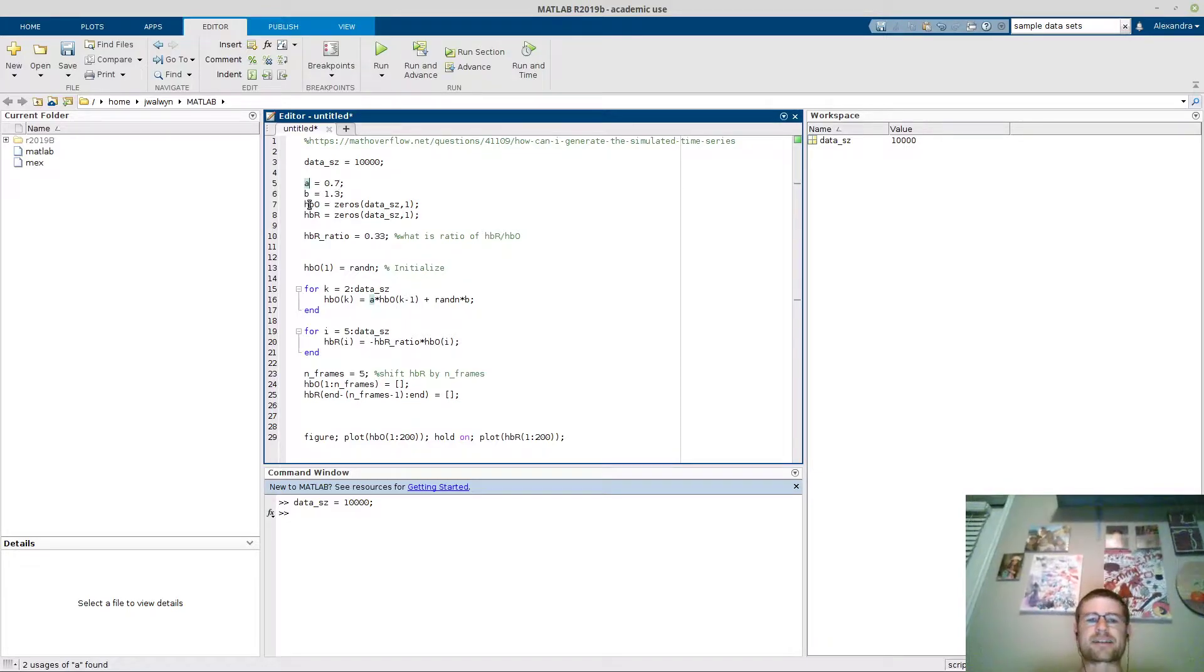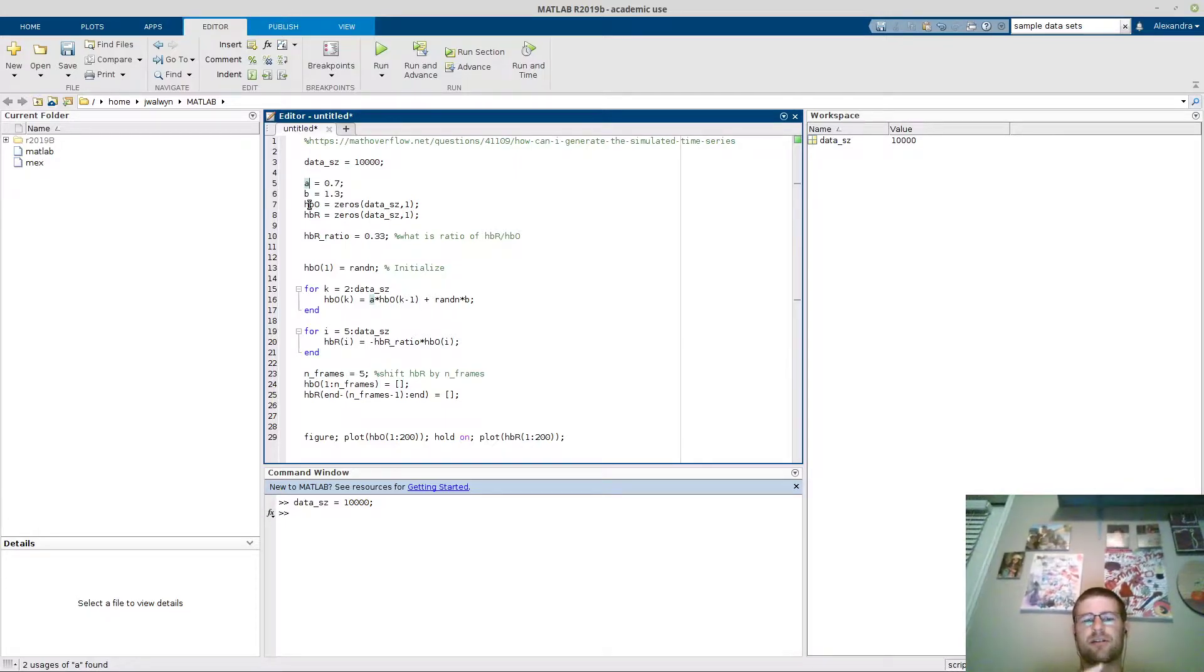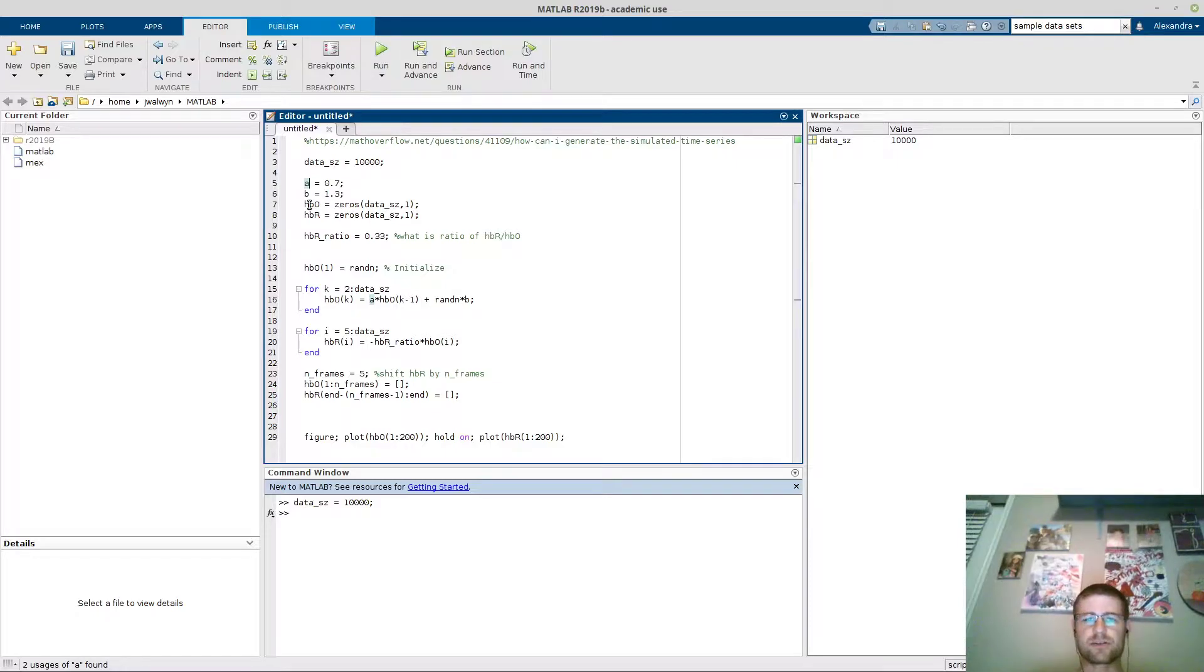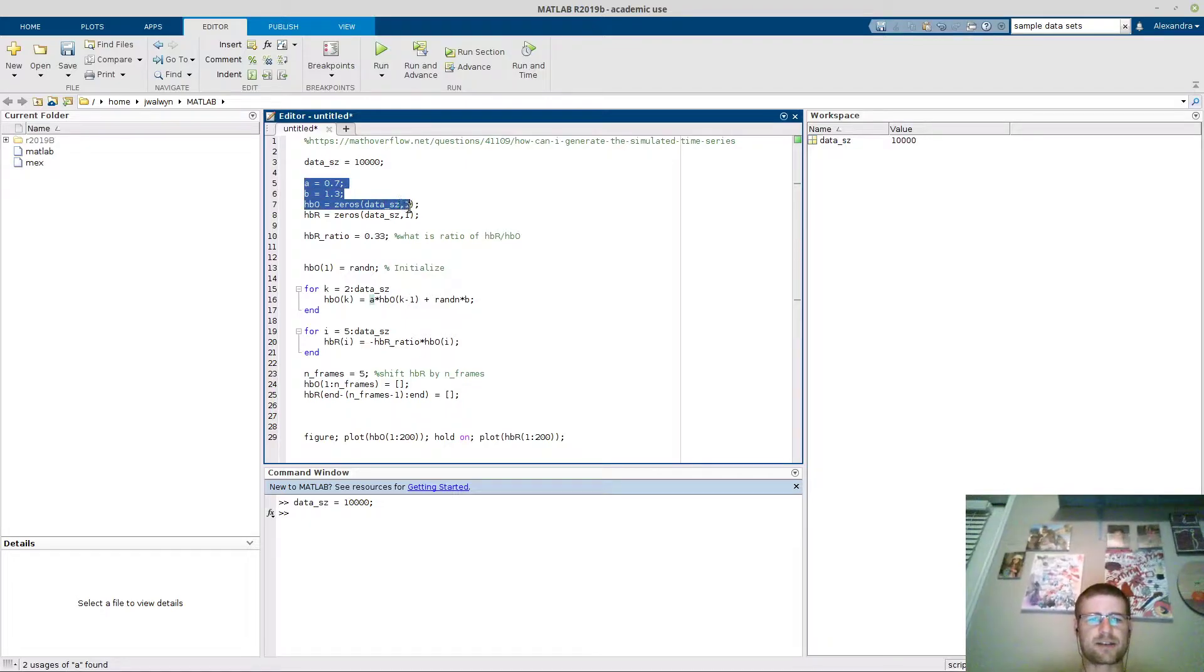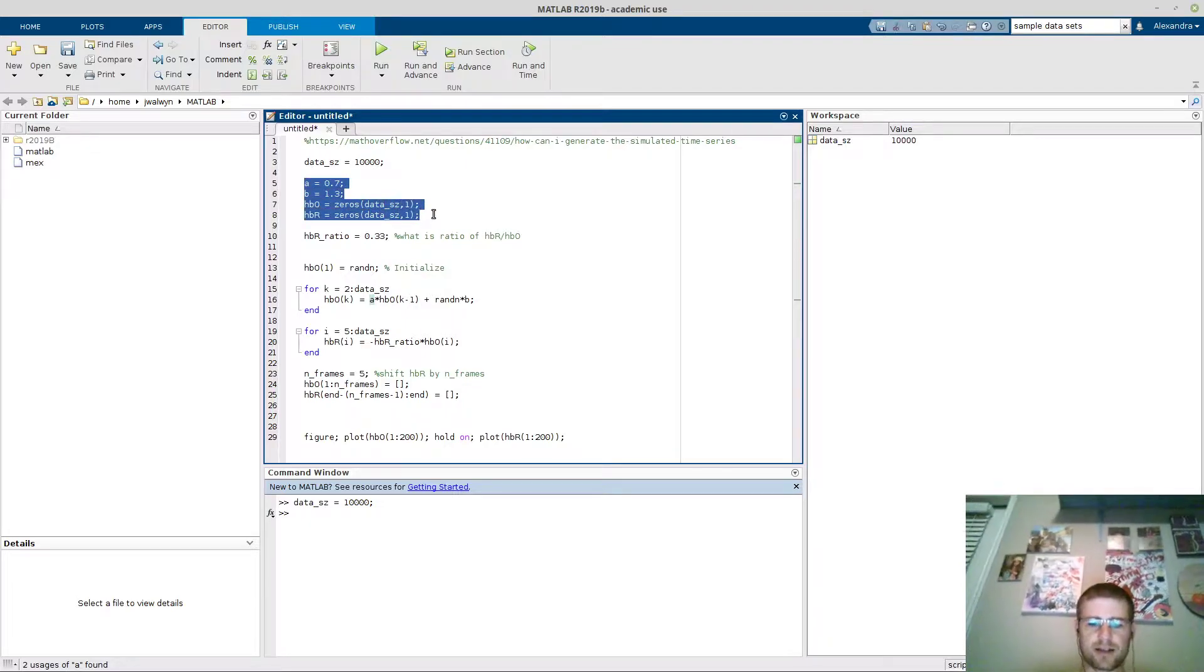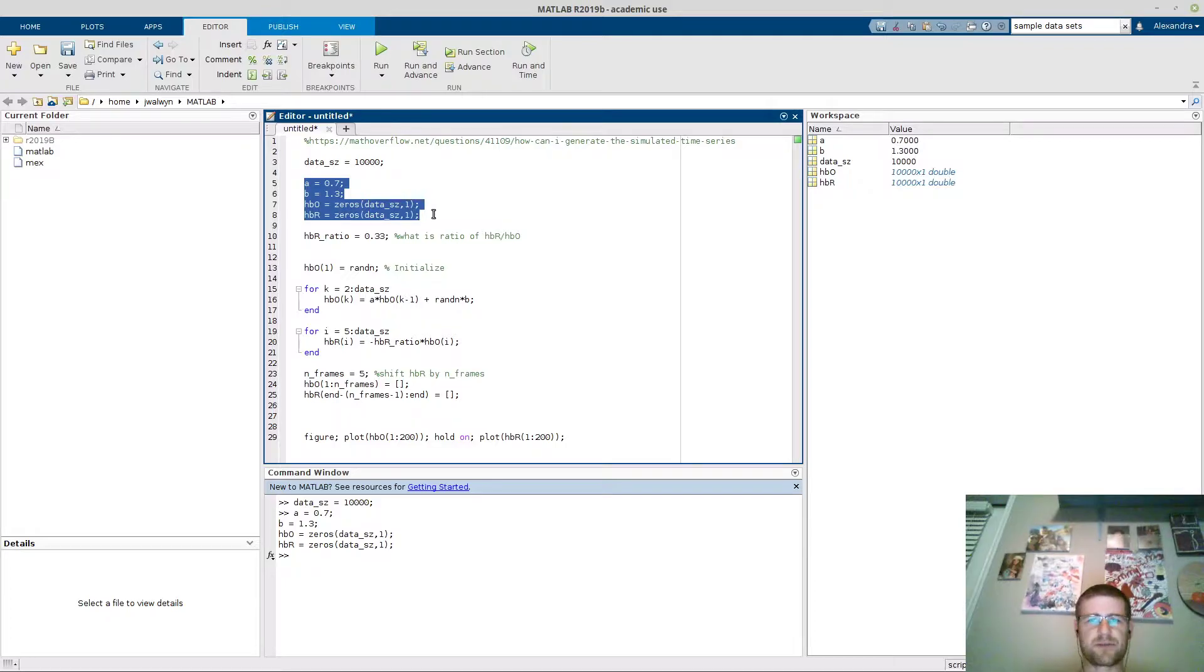The next thing we're going to do is initiate our oxyhemoglobin and deoxyhemoglobin to zeros, and we're going to make it the length of the data size that we have. So let's go ahead and run these little blocks here. I press F9 and it runs those data frames.